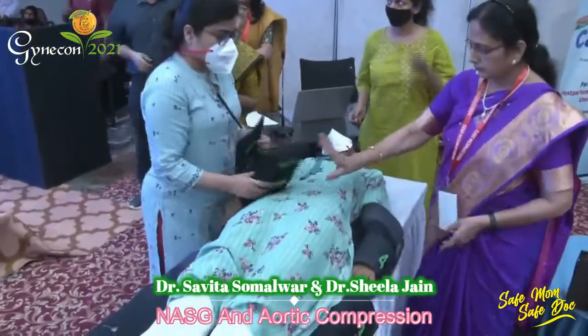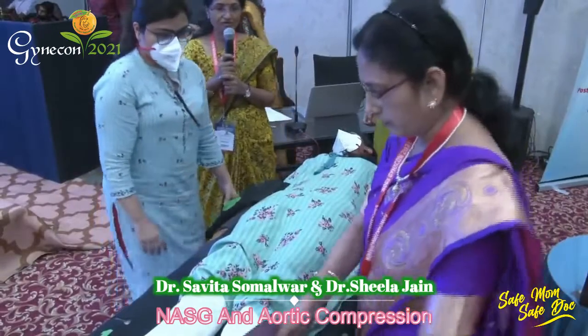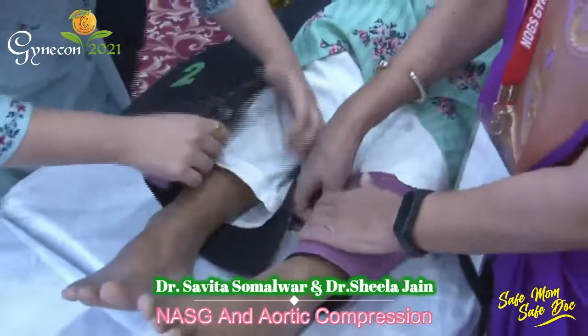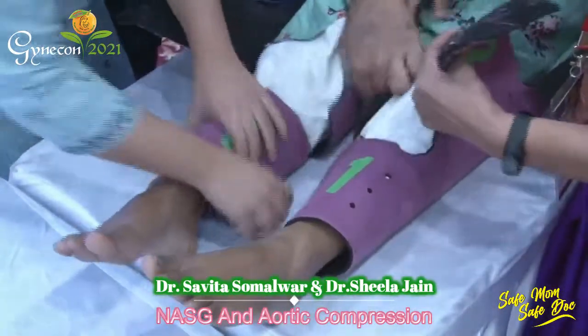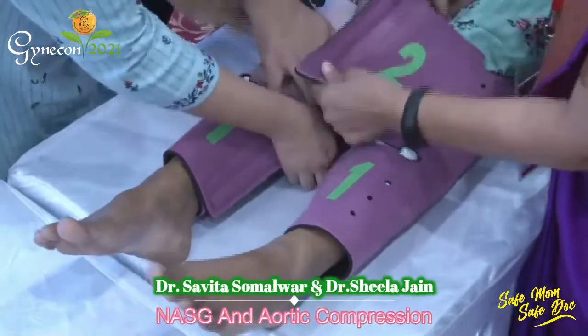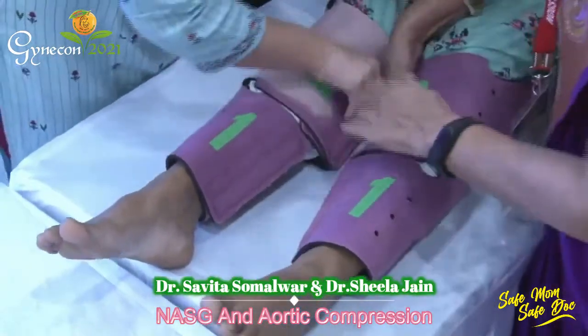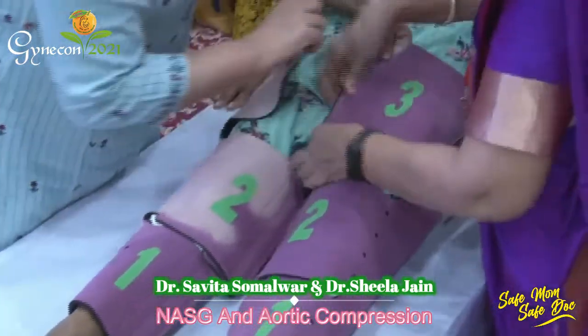Once the garment is placed properly, you start closing the segments from below upwards. Segment 1 is closed tightly across the ankle. Segment 2 is closed tightly across the calf muscles, and segment 3 is closed across the thighs.